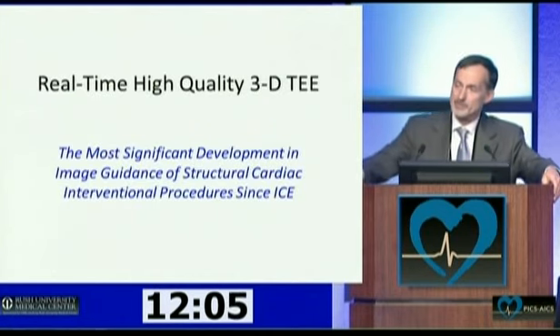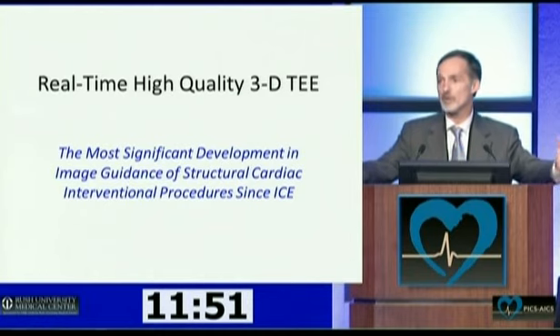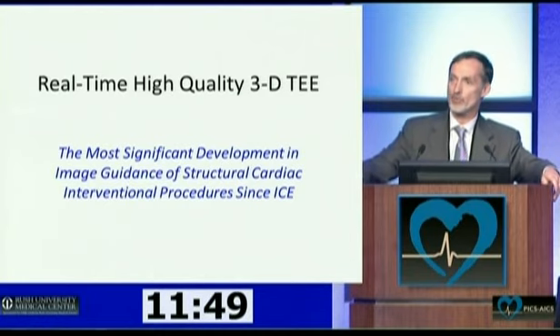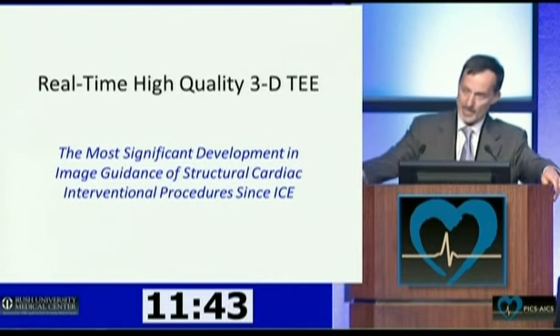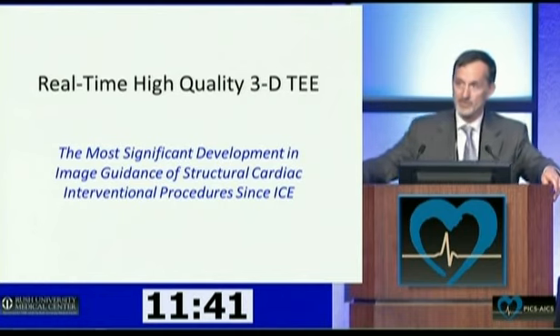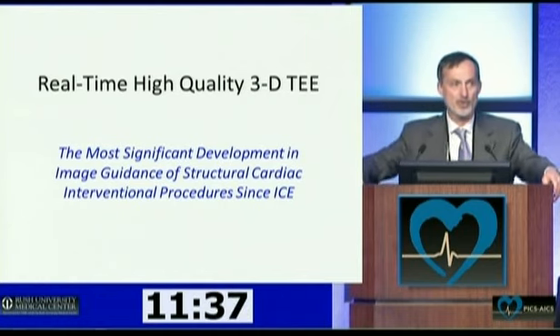And one of them is of course 3D echocardiography, which really has transformed things. If you just think of how rapidly it's become disseminated within a short period of time, it's almost like a new device in terms of its rapid acquisition. And that's because it is so intuitive, it is so useful, and it has been heretofore not really integrated into the procedure room where we used it.